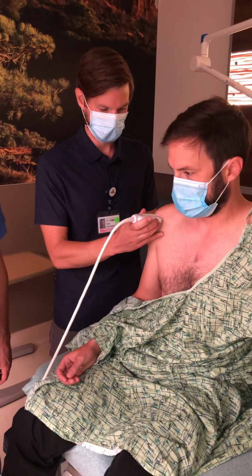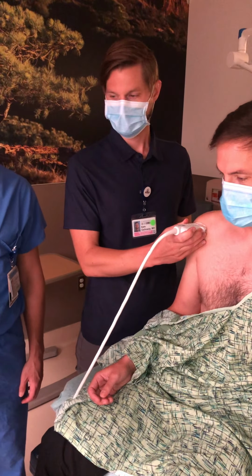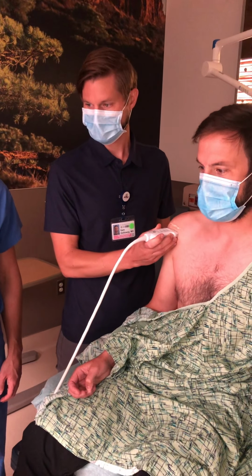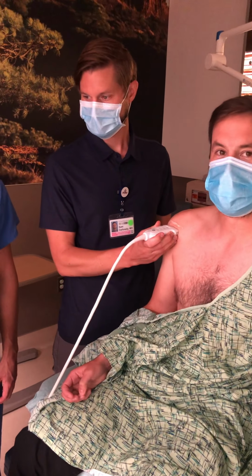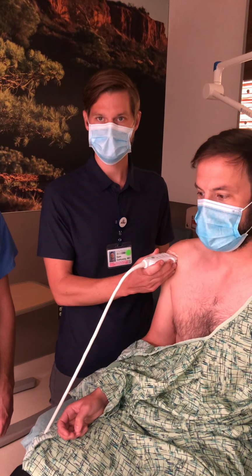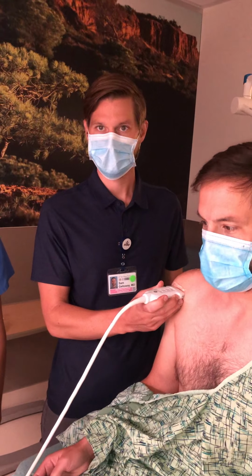We're joined today by Dr. Sam Galloway. Dr. Sam Galloway is from the Family Practice Department, and he subspecializes in sports medicine. Today he's going to teach us a little bit about the topic of a shoulder ultrasound. Dr. Galloway, what do you use the shoulder ultrasound for?